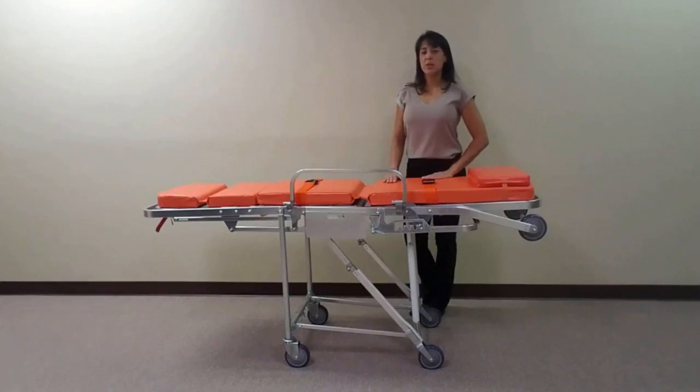With a maximum vehicle loading height of 25 inches, this unit is designed to be primarily used with transportation vans.